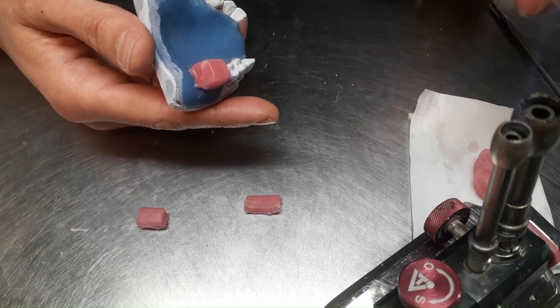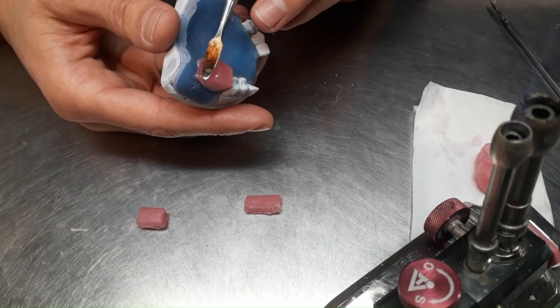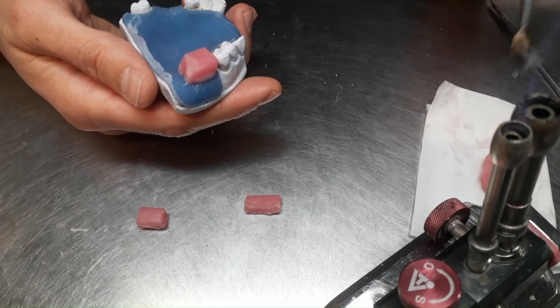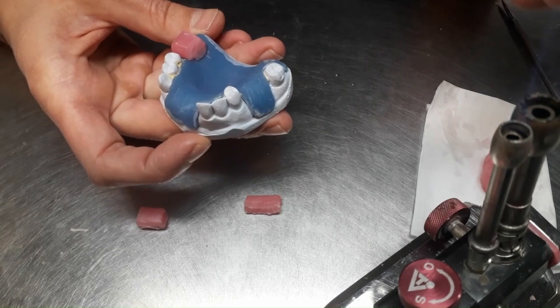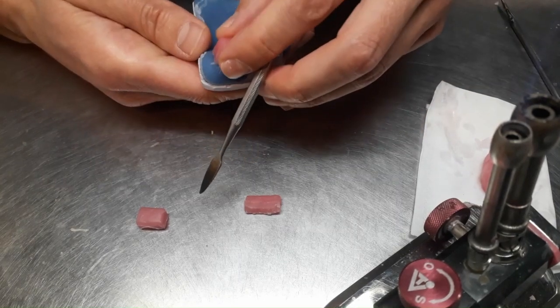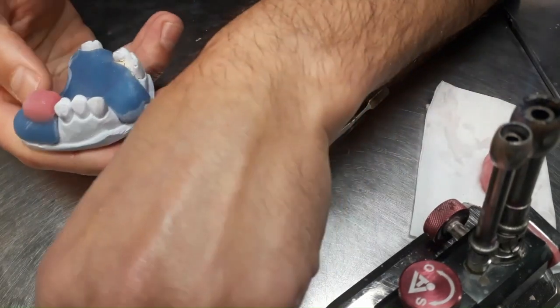of the ridge, the bite block will be oblique in the distal zone to avoid premature contact with the mandible, with the ramus of the mandible, right? So while the wax is still hot, you can determine the exact position.